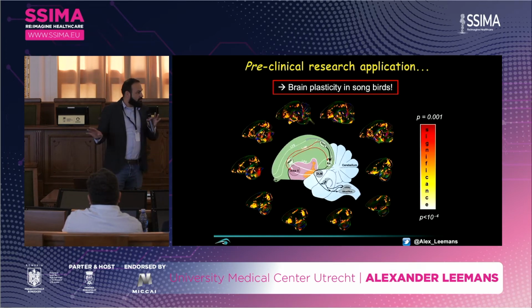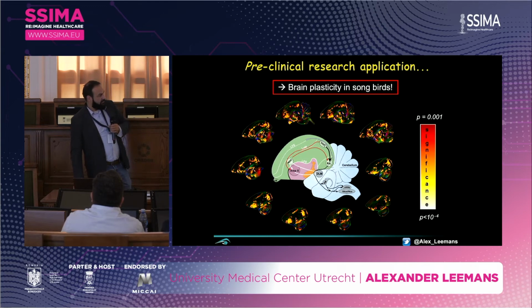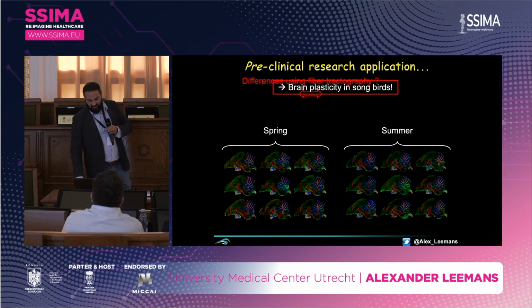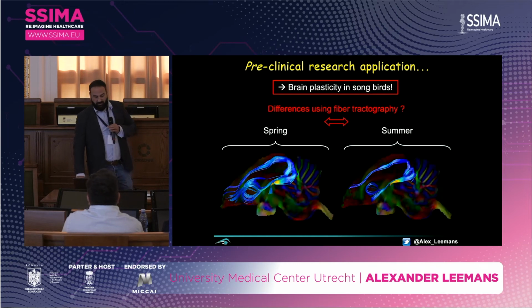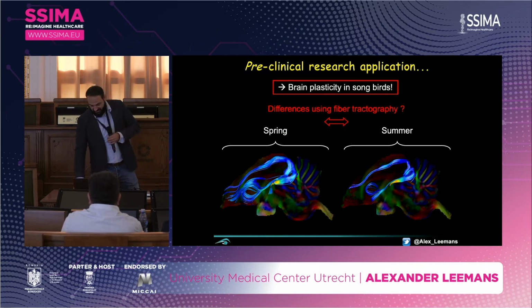Very long story short, yes, we could find through some voxel-wise analysis regions corresponding to nuclei that are related to song and speech that showed significant differences. And the same using tractography. So it seemed like in spring, we had stronger connections, more pathways connecting these song nuclei. So that was very exciting especially for the biologists. I was just a facilitator with the technology, but I'm happy to be involved, obviously.